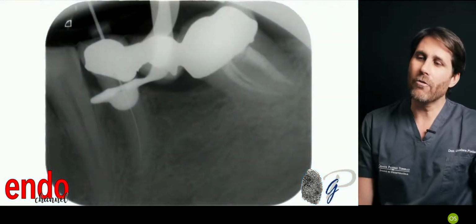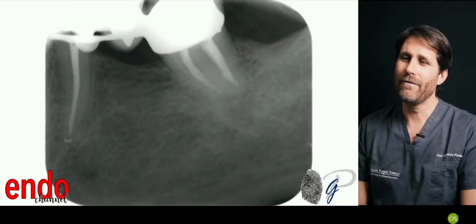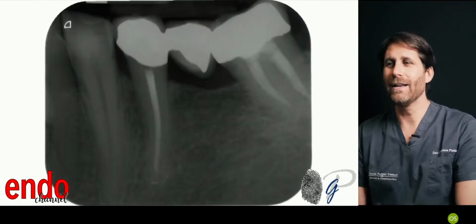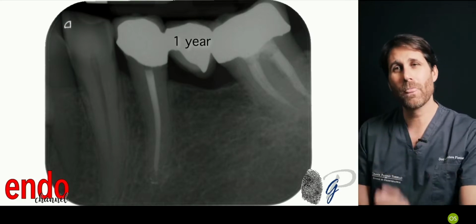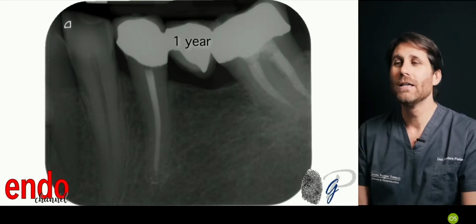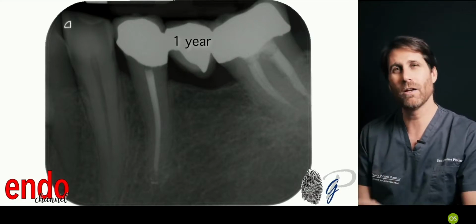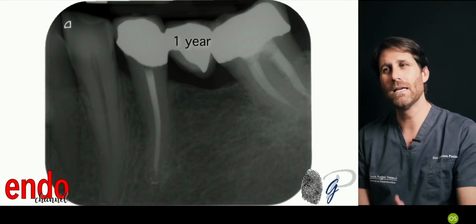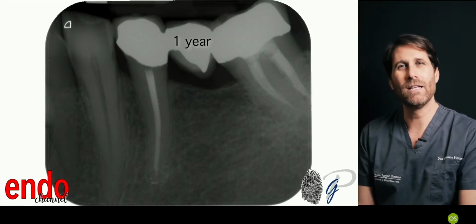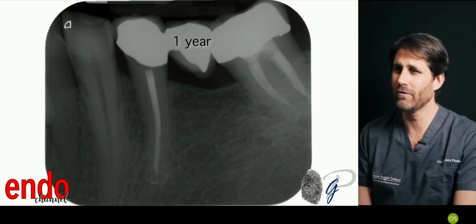This is the working length radiograph with the instrument inside, the final radiograph after the root canal filling, and the 1-year follow-up. So this is what I think is good to do when passing through a crown, even if I don't do it very much. Just in primary treatments, when it is needed because the crown is well done. Use this technique and increase the visibility of the light by beveling the occlusal surface, because especially in metal crowns it's very difficult to have good visibility down there for finding the orifices.